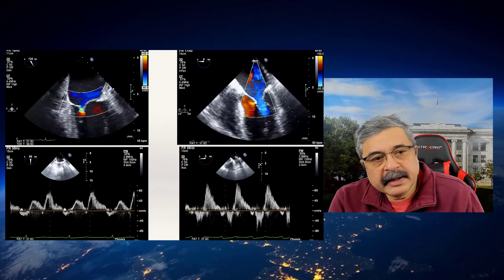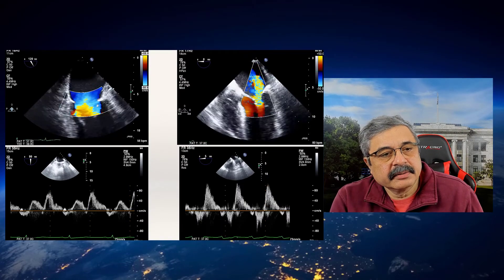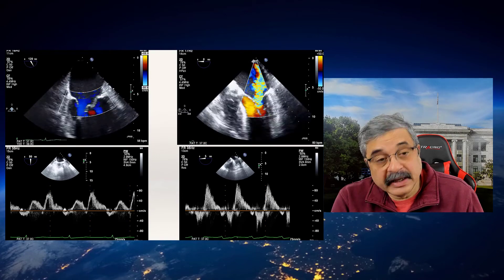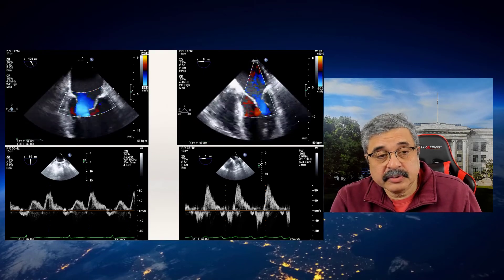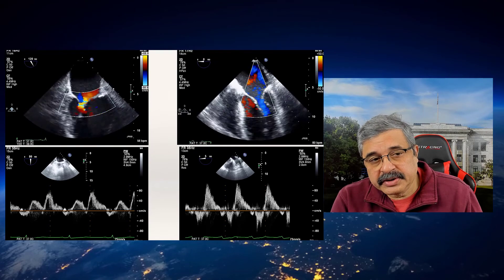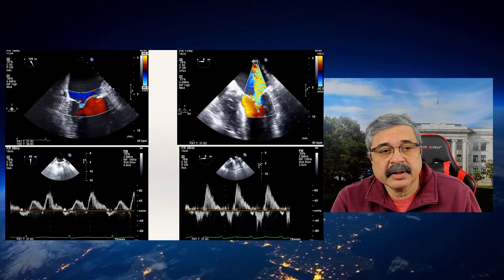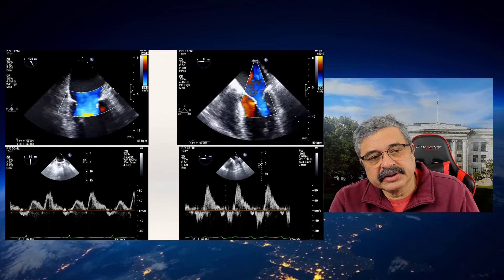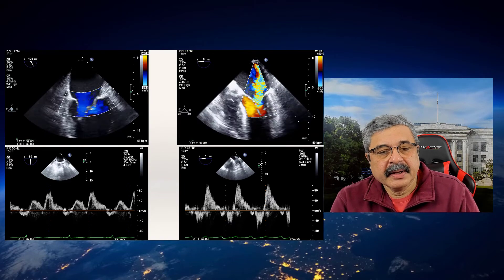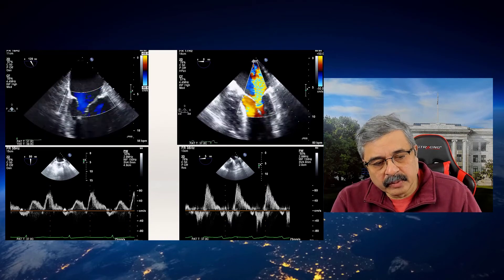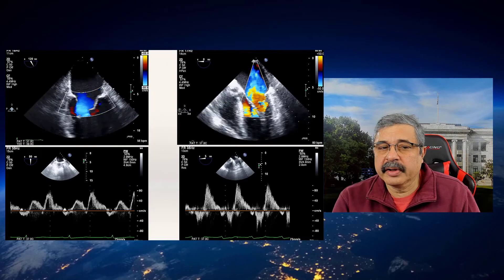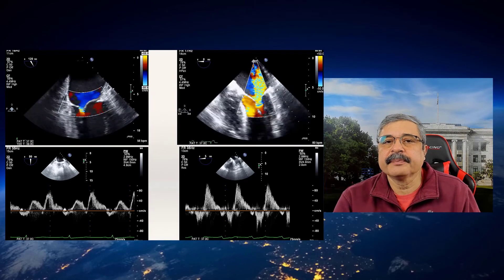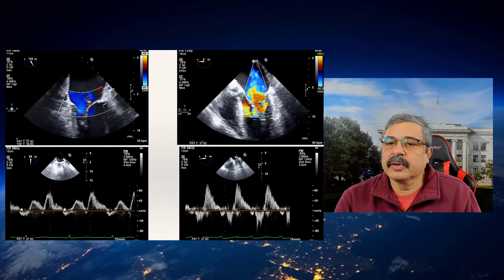In the final analysis, the video on the left shows less mitral regurgitation. We reported the patient had moderate mitral regurgitation, though the jet is not being captured as well as it should be. It demonstrates a normal pulmonary venous inflow pattern with S and D waves and atrial flow reversal. Later on, the patient develops severe mitral regurgitation.